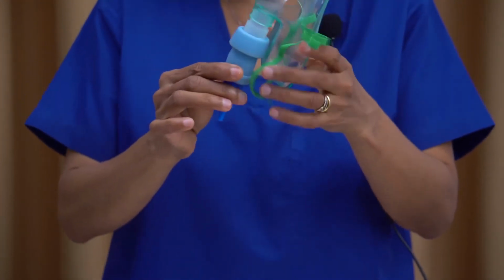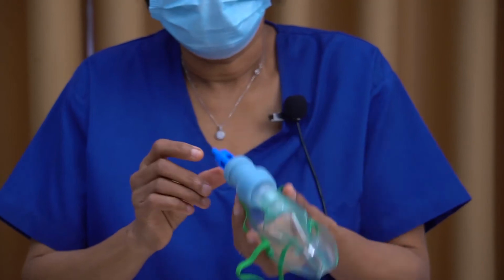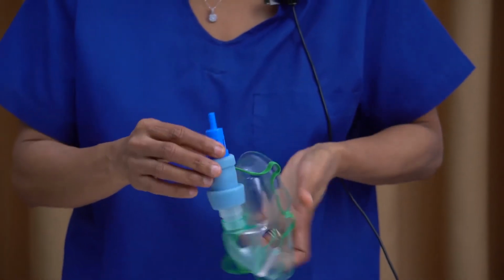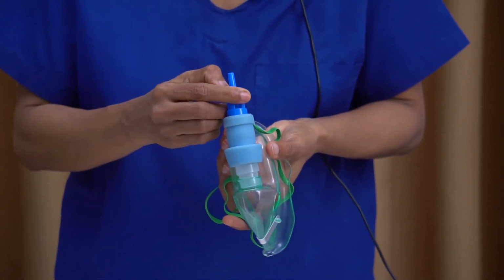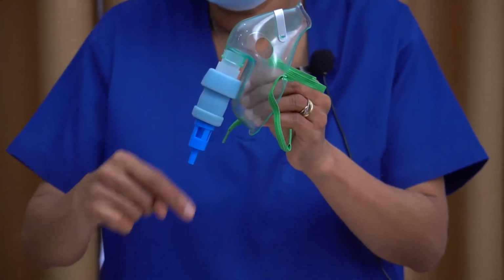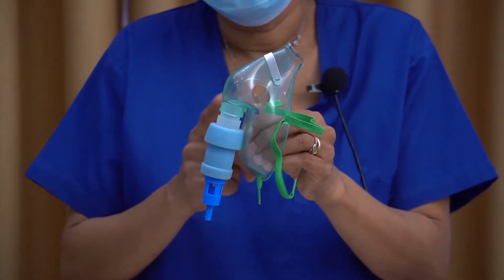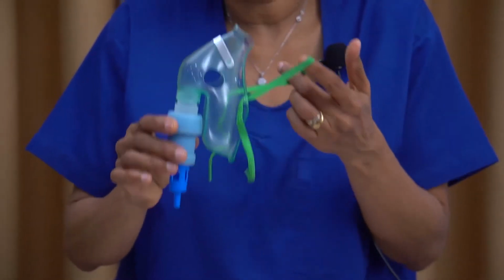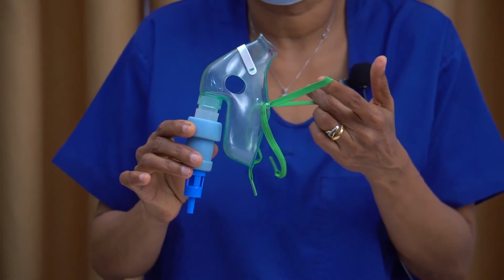You have to connect the Venturi device to the face mask like this, and once you deliver this flow rate, for example, this Venturi piece says it delivers 24% once 4 liters per minute flow is given. So if you give 4 liters of flow rate to this face mask, 24% oxygen is delivered. This face mask need not be a tight fit on the patient, so it's more comfortable for the patient.